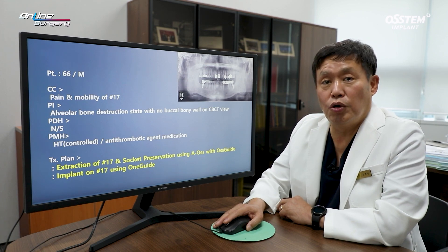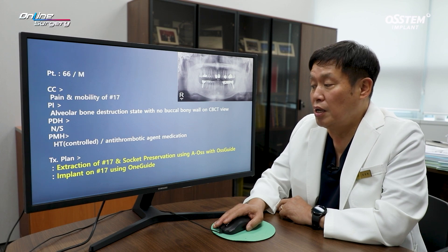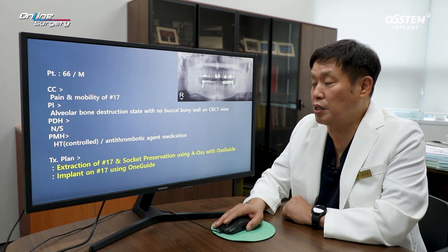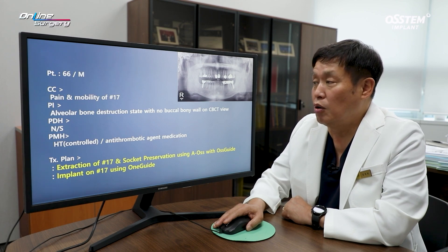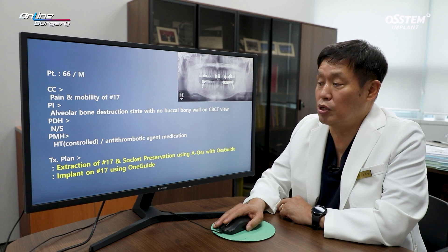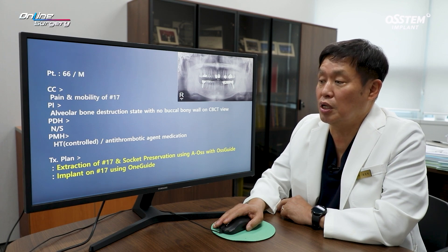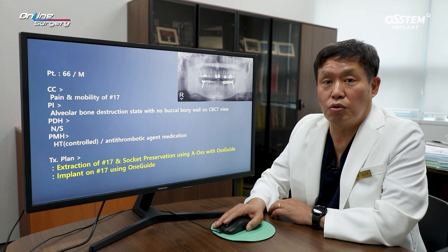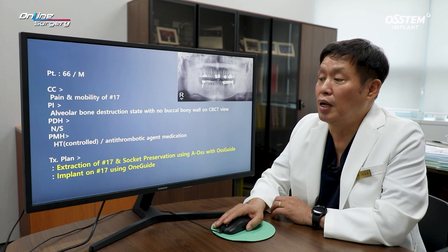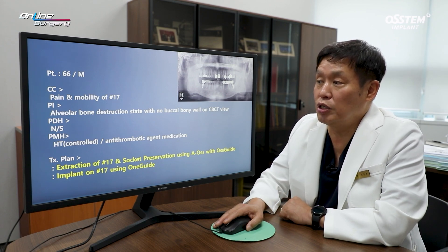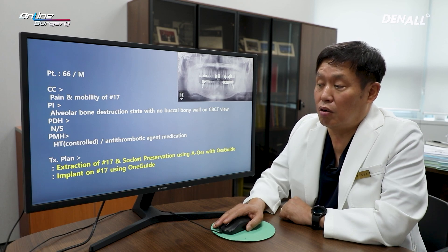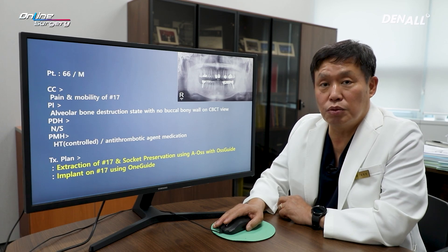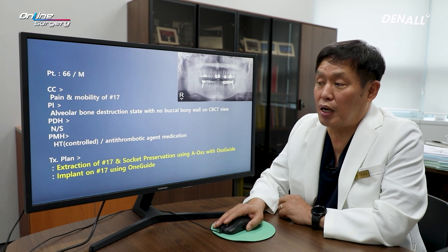Extraction was done on number 17 first because there was no bony wall. On the buccal side, AOS particle bone and OS-guide were used. Socket preservation was done using a collagen membrane, and One Guide was used to place the implant in number 17 because there was no buccal bone whatsoever when One Guide surgery was performed.